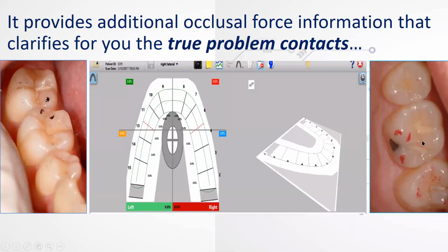This patient has 3 large paper marks on the first molar with very healthy tooth structure under those paper marks. Here we have exposed dentin with paper marks really at the periphery of the exposed dentin. I'm sure many of you have seen that when you try to mark exposed dentin, nothing really marks there. Well, there's a very good reason for that, which I'll talk about in a second. But notice that with these 3 large marks, the tooth structure is extremely healthy. And here you have exposed dentin.